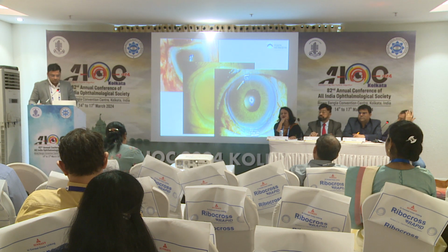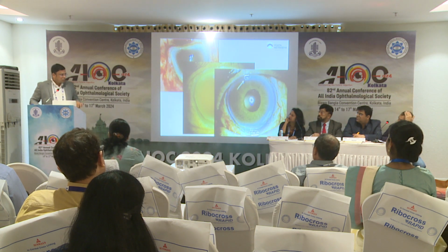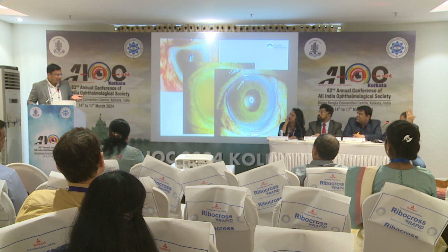What is the intraocular pressure after surgery? Madam, the intraocular pressure was low after the surgery because of so many sclerotomies. So we had to pad the eye the next day. Slowly the pressure picked up. Fortunately, there was no choroidal detachment on B scan. So we kept him on oral steroids, and slowly the pressure picked up over a period of 1 week.